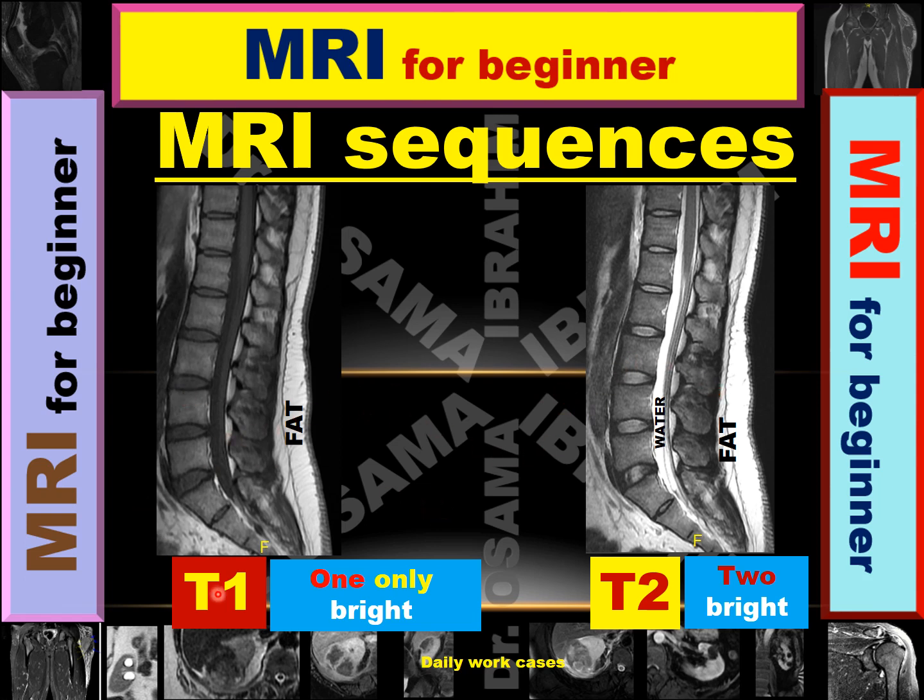signal from T2. As we described before, the T1 signal depends on the quick realignment of the protons. It gets high signal in T1, like this fat in the subcutaneous area and this lumbosacral spine, which appear as a high signal in T1. However, the CSF in the spinal canal is low signal. So only one structure, fat, becomes high signal, not water. Fat becomes high signal only. So this is the T1 sequence.